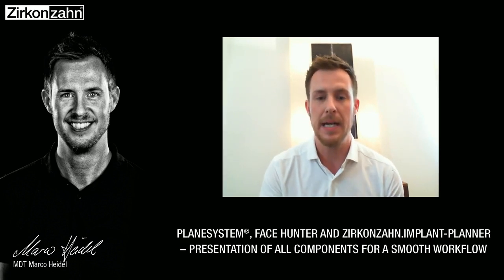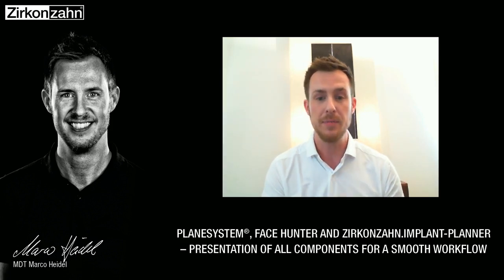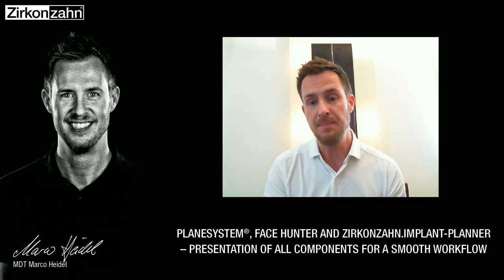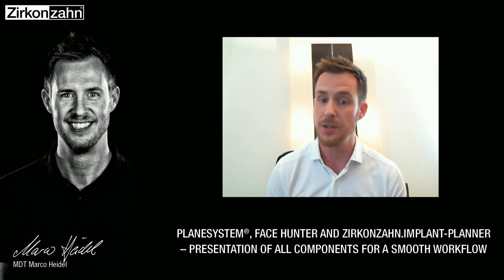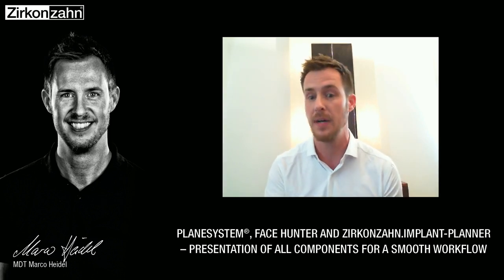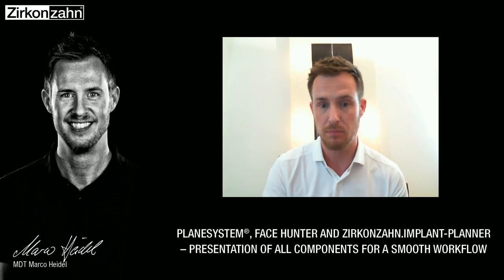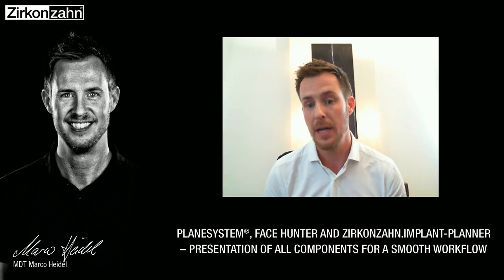Well, I prepared some topics for you. I will speak shortly about intraoral scans, then we go over to the registration process, then how we capture the 3D facial scans, then there's a really important part as well, how I can create individual occlusion surfaces with a special device. I will explain it later as well. And then we come to the whole designing step. And afterwards I will also talk about the implant planner.